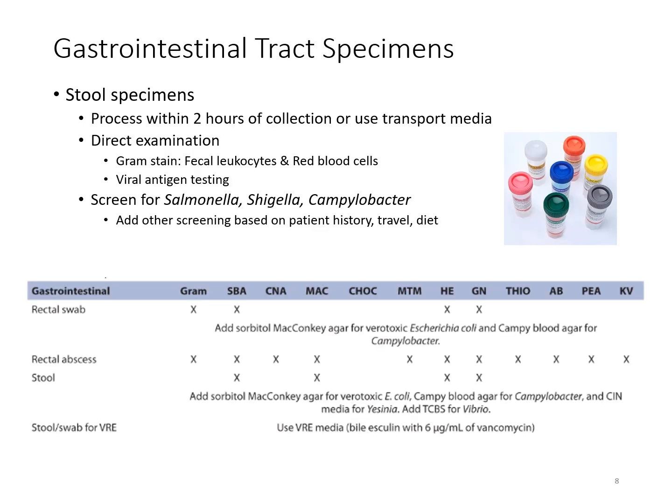Stool specimens should be processed within 2 hours of collection, or they should be placed in some sort of transport media. Occasionally patients may be sent home, depending on what particular organism is suspected to cause the infection, with one of these containers here, and some other type of sterile collection container, like a larger one, for them to collect the sample of their stool and add to these smaller containers that will help with preserving the specimen.